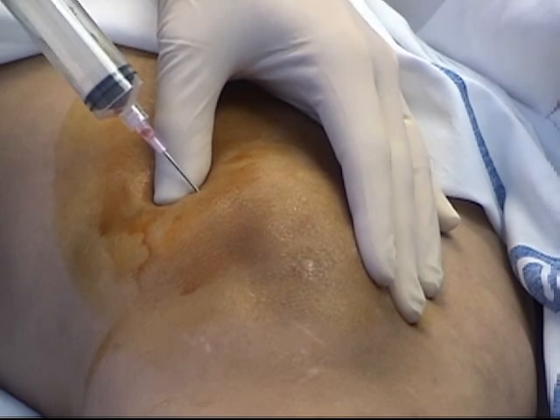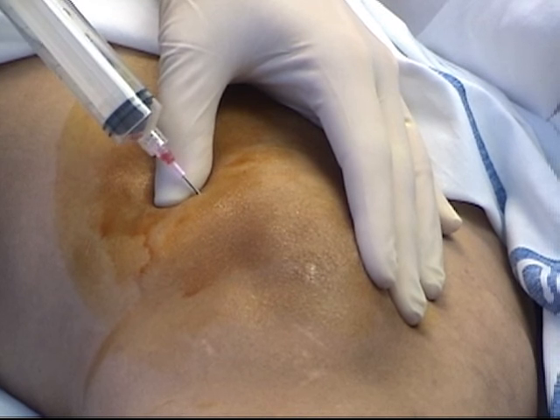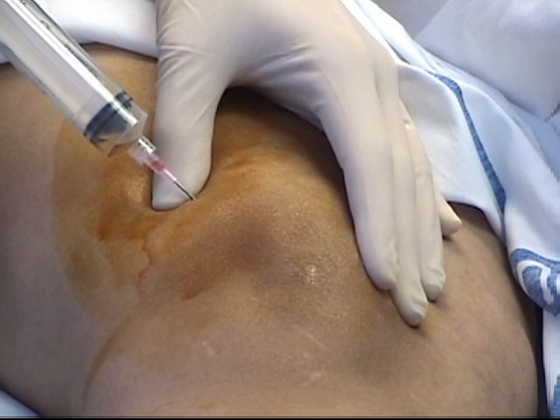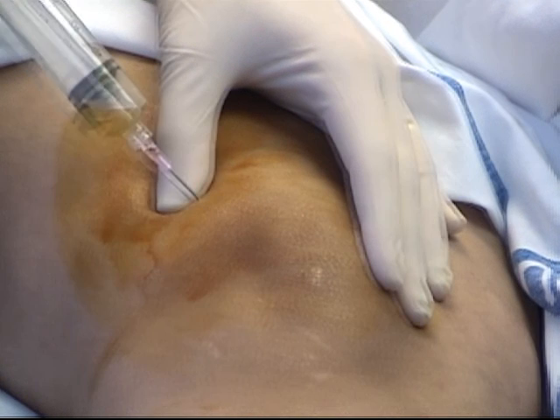Once the fluid space is entered, obtain a sample for diagnostic purposes. For tense effusions, withdrawing larger volumes of fluid, up to 50 cc at a time, can reduce pain and improve range of motion.